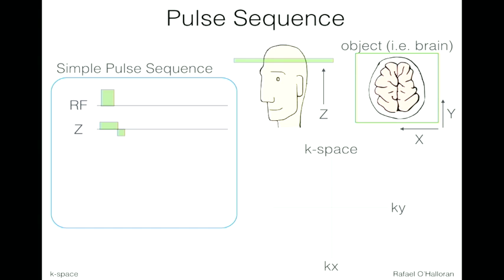And now we'll look at the K-space of this object and how to move through it with the rest of the sequence. So just like the image has an X and Y direction, we have a KX and a KY that correspond to those two axes. And to move through them, I'll use gradients, magnetic field gradients. If I play out a little pulse on the Y gradient, that will take me up in the KY direction. So I've moved up a little bit in KY. And if I play out a pulse on the X gradient, then I'll move in the X direction. And I put a negative pulse here, and that shows you that I go to the left. So left is negative, right is positive in this convention. And if I do another one on X, then I'll go across K-space from left to right.